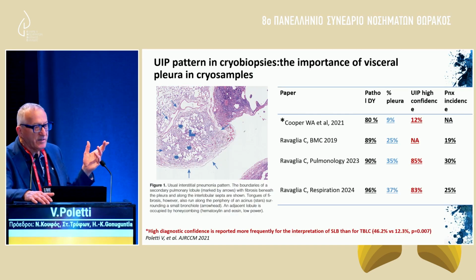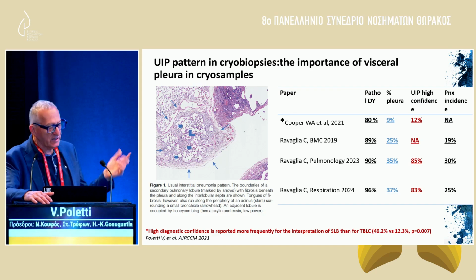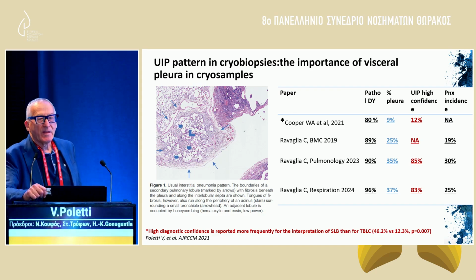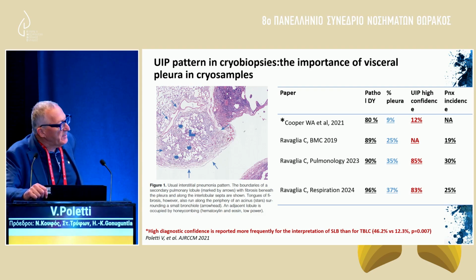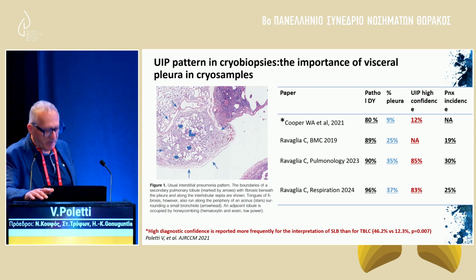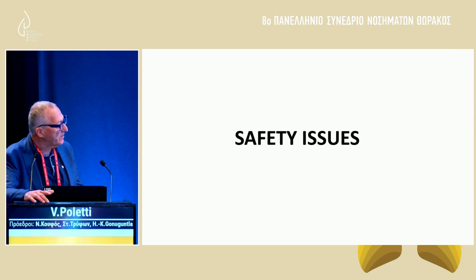And again, why is the pleura important? This is a paper in preparation. We collected different studies, and you see the visceral pleura rate in samples correlates with the diagnostic confidence by pathologists. So don't be so afraid to have pleura in the samples.